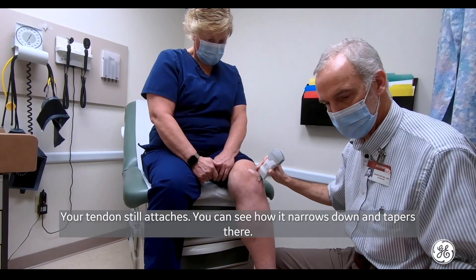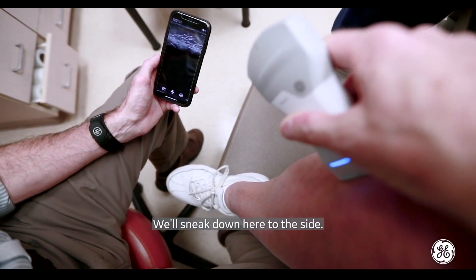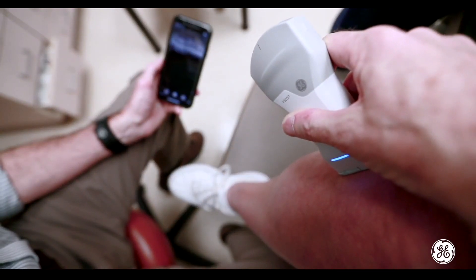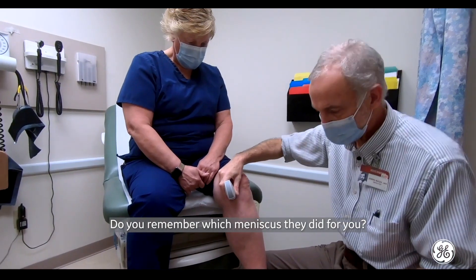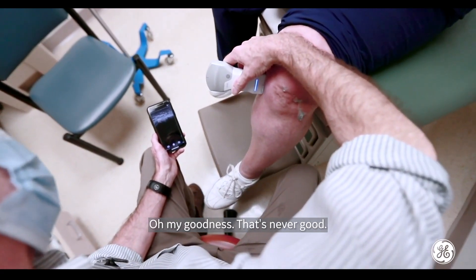The cap looks good. Your tendon still attaches — you can see how it narrows down and tapers there. We'll sneak down here to the side. Do you remember which meniscus they did for you? They called it a trifecta. Who cares? Oh my goodness. That's never good.